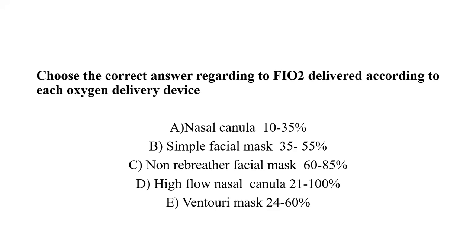What about the others? Non-rebreather face mask, 60 to 85%. True or false? This one can be true. It is true.